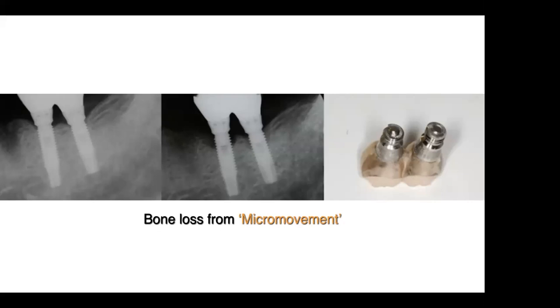So the screw loosening causes inflammation around the implant, and that'll cause some bone loss around it. And the bone loss can act as a fulcrum point for the implant to fracture at. So that's pretty much the vicious cycle, starting from the loosening of the screw, ending up in implant failure even.